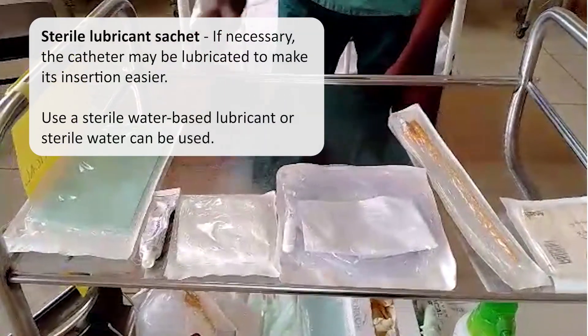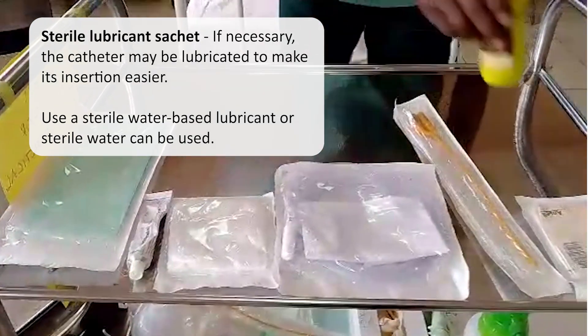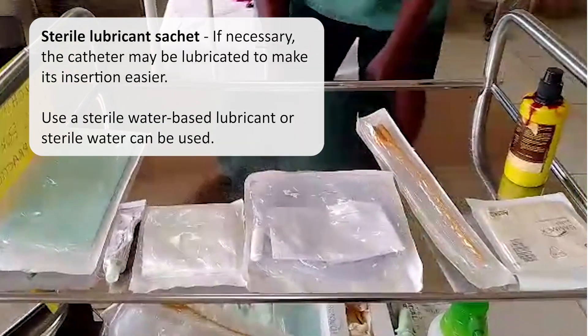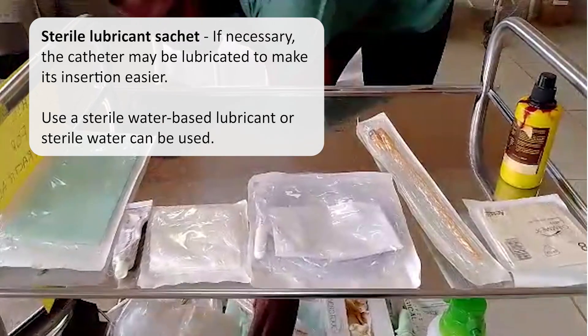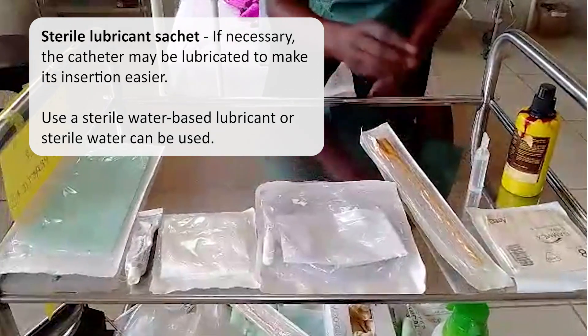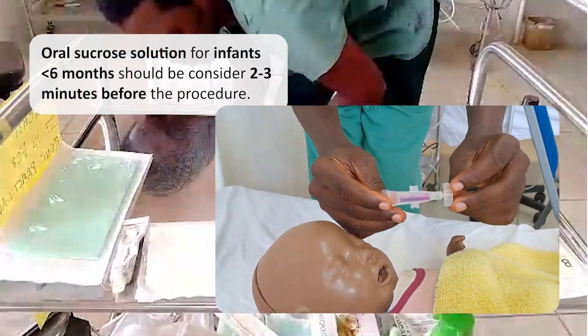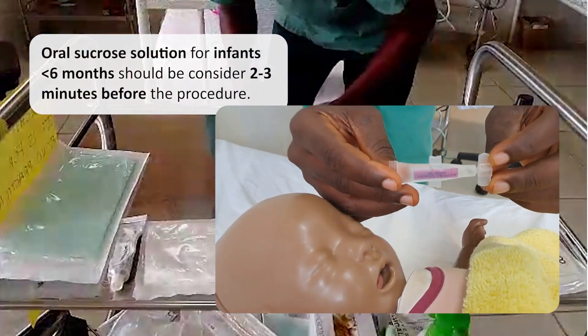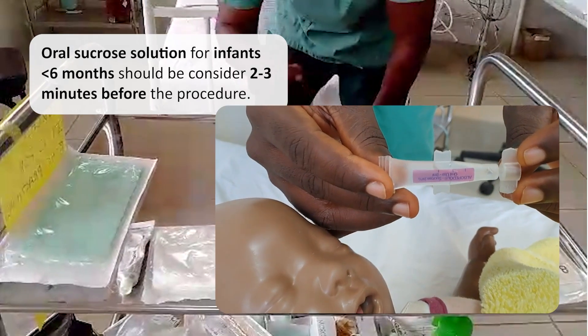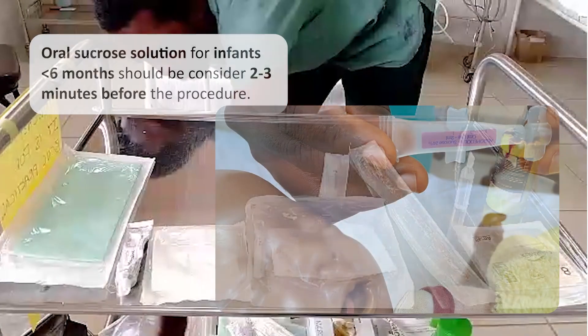Sterile lubricant sachets can be used if necessary. The catheter may be lubricated to make its insertion easier. The use of a sterile water-based lubricant or sterile water can be used. Oral sucrose solution for use in infants less than six months should be considered as an analgesia two to three minutes before the procedure.